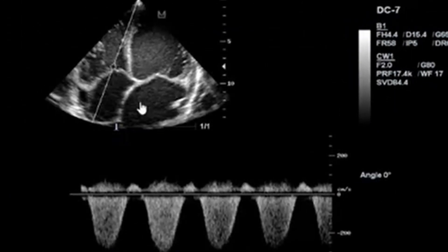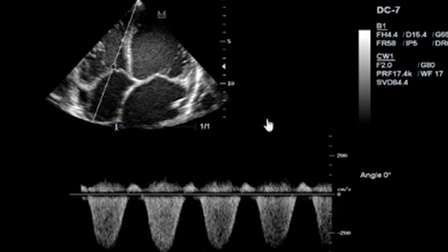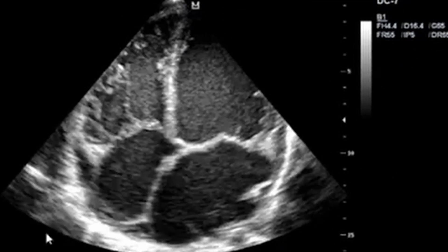Here you can see the tricuspid valve, and there is also severe tricuspid regurgitation. So you can see that these three valves are all showing regurgitation, but the regurgitation is more severe on the mitral and tricuspid valves.